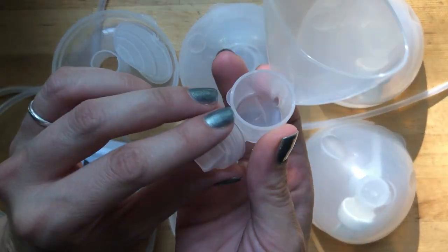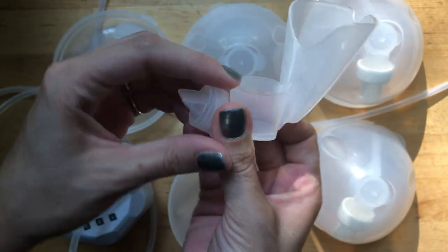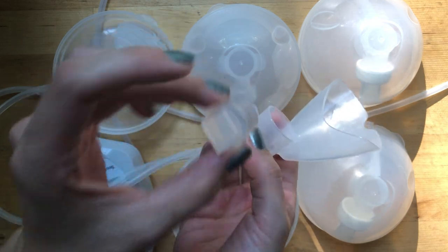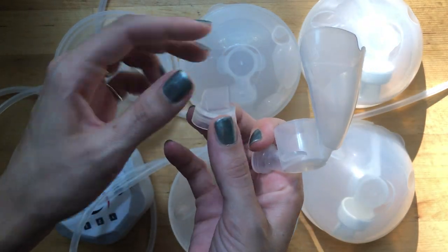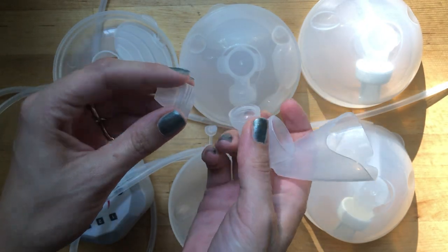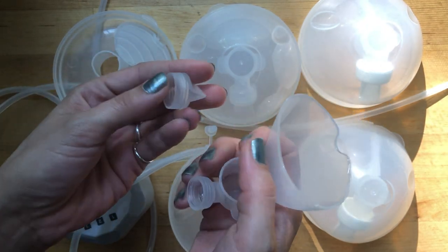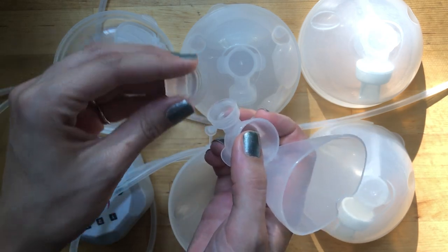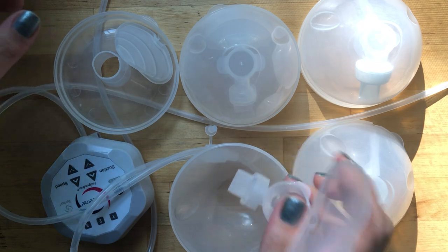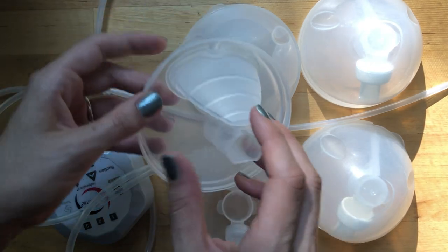There's also a little duck bill valve that you can pull off easily to clean and replace. These do wear out sometimes, so you might need to replace them. Replacements are easily found on Amazon - I've bought Freemie brand ones and off-brand ones and both worked just fine.